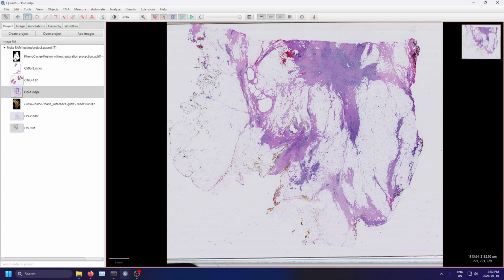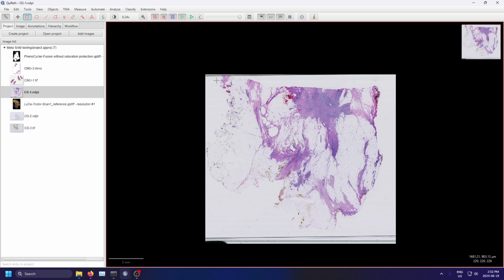We identify whole tissue here, in tissue that has a lot of empty space, presumably fat. And again, all that's being passed, at least from my understanding, is what's being shown on the screen right now. So if we draw a rectangle around this, we need to turn on SAM again.